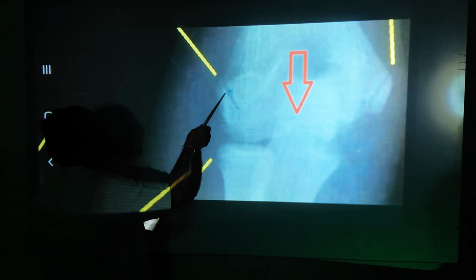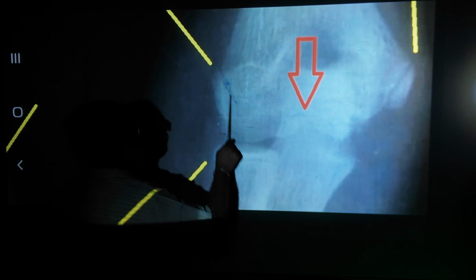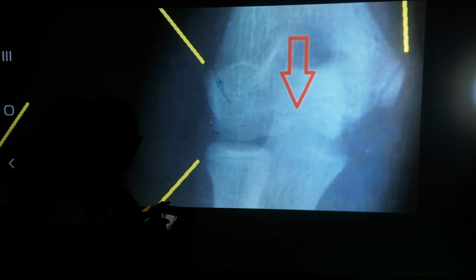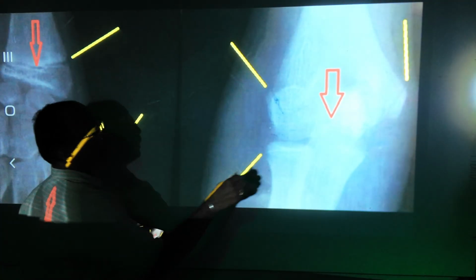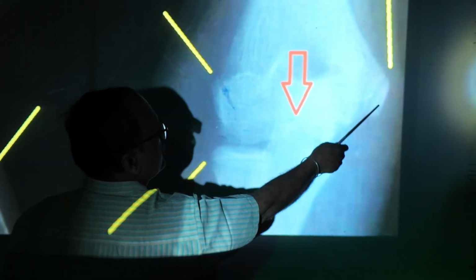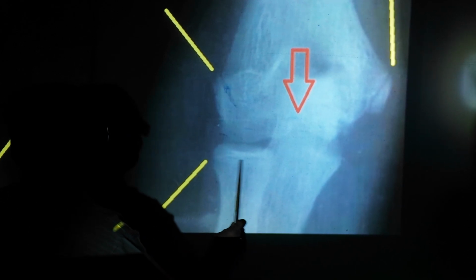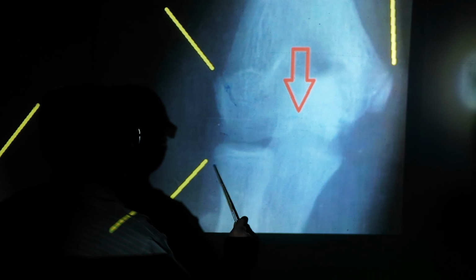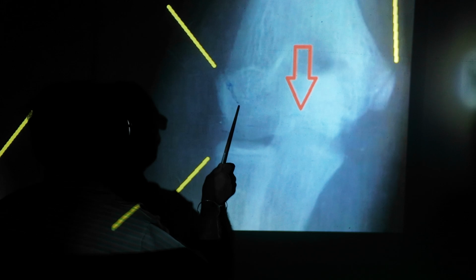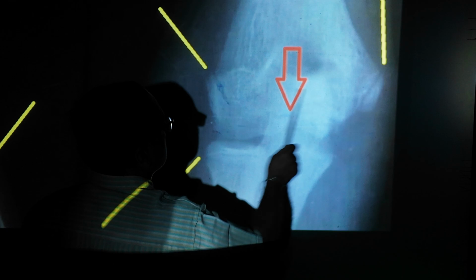Here we can see lateral epicondyle, capitulum, trochlea. These three are united, conjoint epiphysis, whereas medial epicondyle forms a separate epiphysis, which unites with the shaft directly by the age of 16 years. Upper end of the radius not yet fused, age below 16.